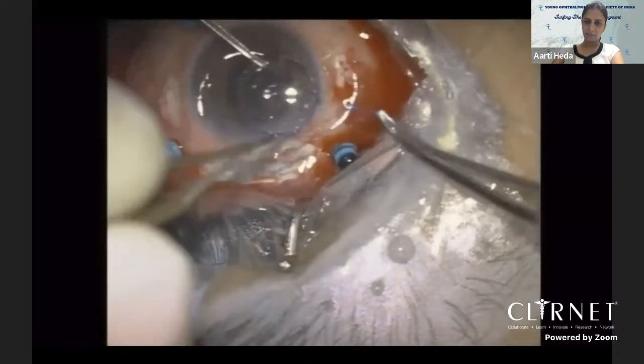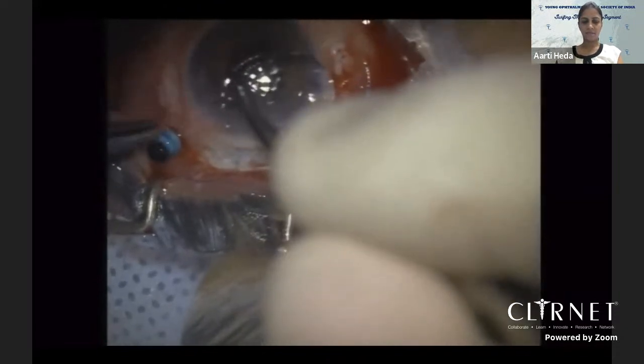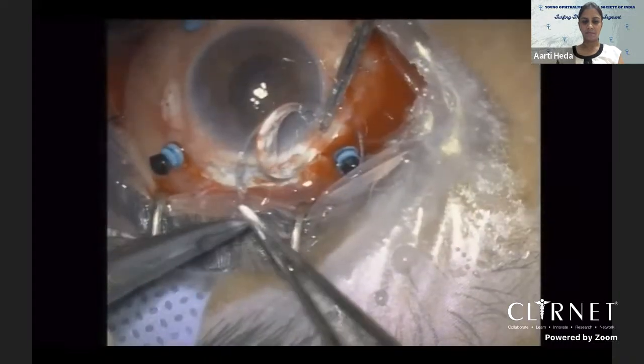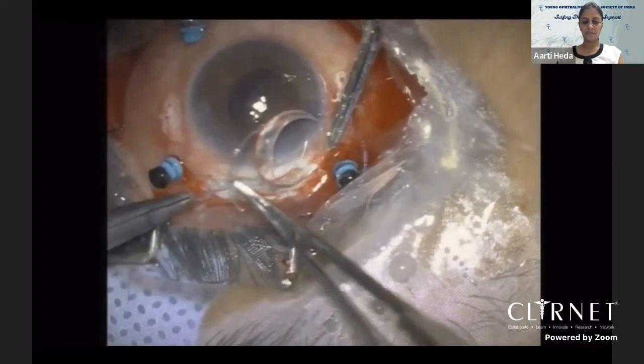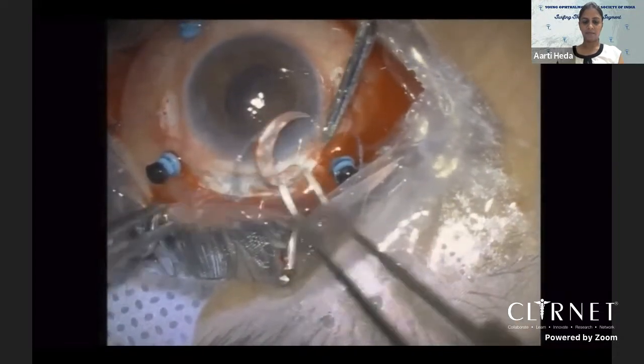So these micro movements can be a bit challenging in the beginning, but trust me, when you get the habit of doing these surgeries often, it becomes easier and doesn't take much time. You can take help from your assistant and ask him to hold the IOL while you are tying these knots.